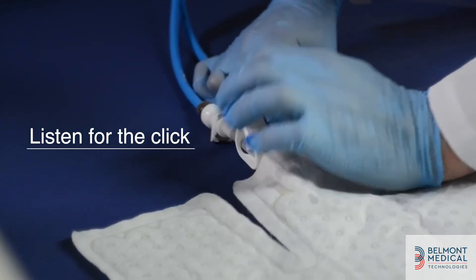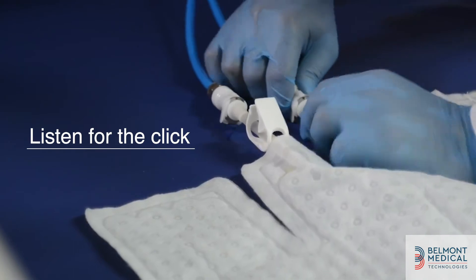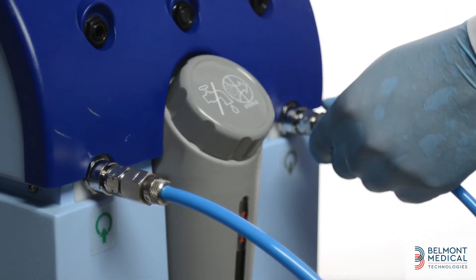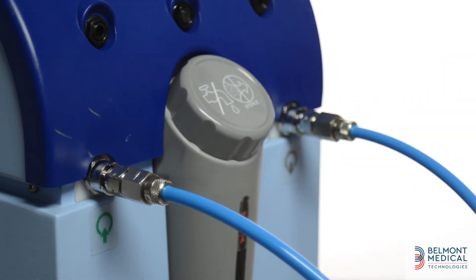Connect the hoses to the wrap and to the CRITICOOL system as shown. When connecting the hoses to the system, be sure to press the latch on each hose as you insert it. Either hose can be inserted into either side.